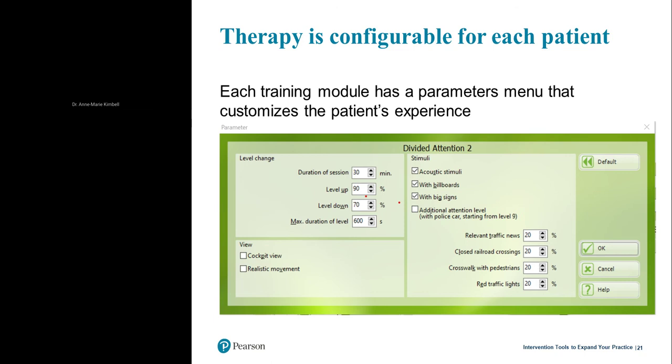You can use the default values that are shown here, or they can be adjusted. Sometimes you do want to make the task more difficult while remaining at the same level of difficulty. So you're able to make those kinds of changes. And you can limit the solution time.